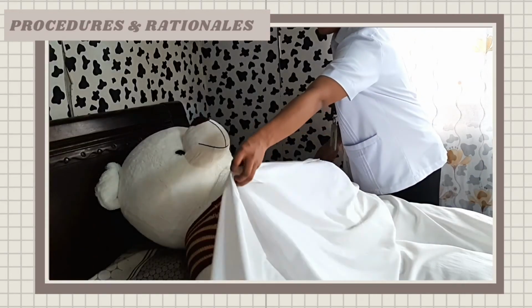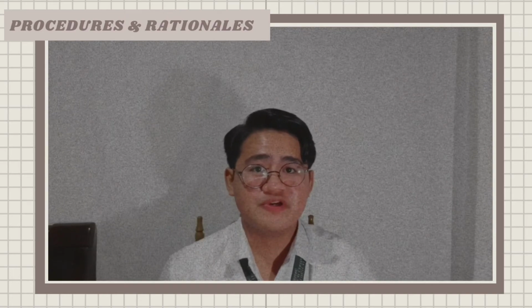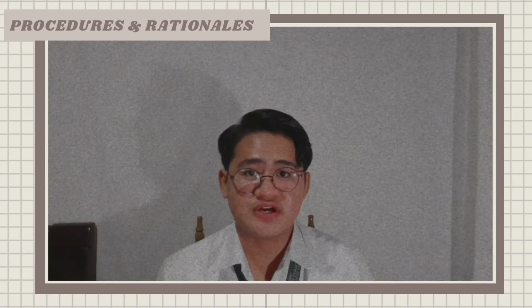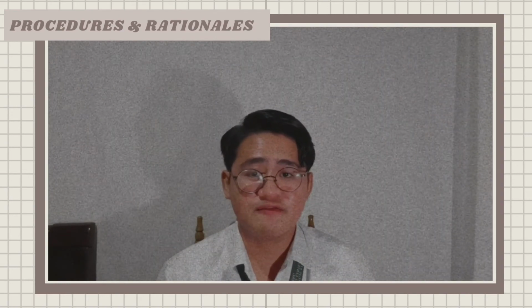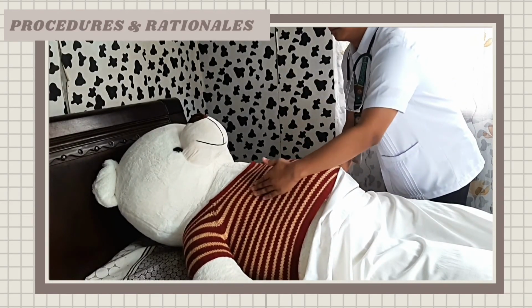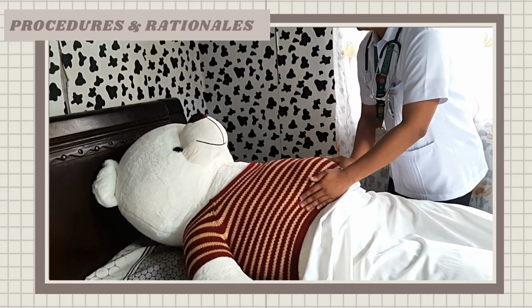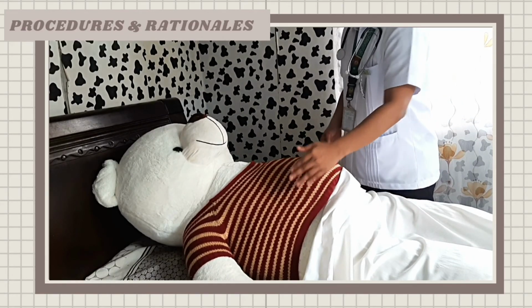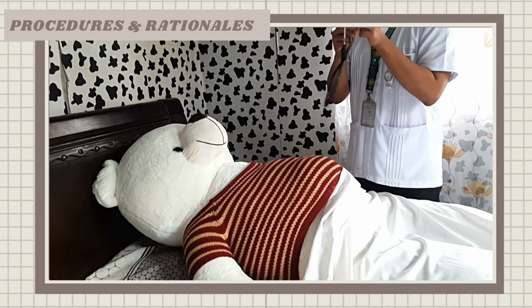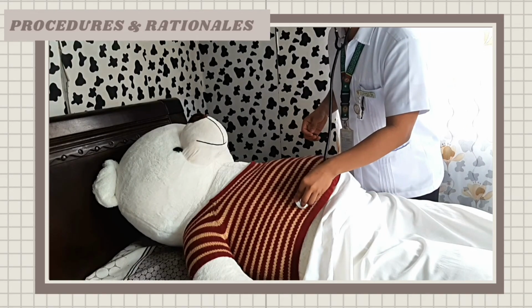for accountability purposes. Now lastly, you have to determine the fetal heart tone. Now proceed to Leopold's maneuver so that you will be able to determine the fetal position. This will help in locating the fetal heart tone. Now after determining the fetal back, place the bell of stethoscope and auscultate the fetal heart tone to identify the quality and quantity of fetal heart tone.